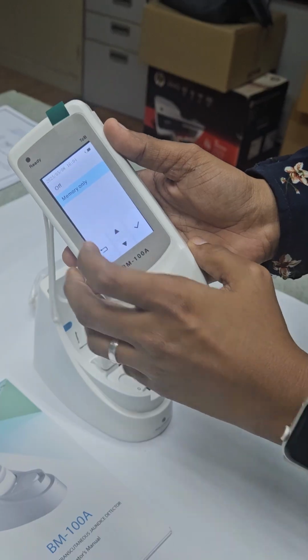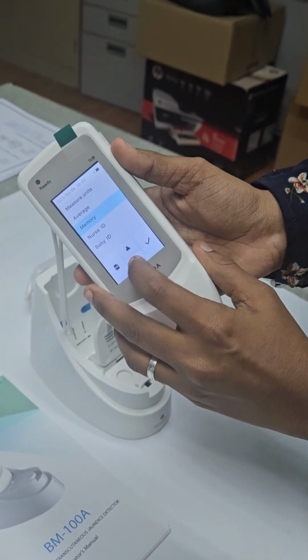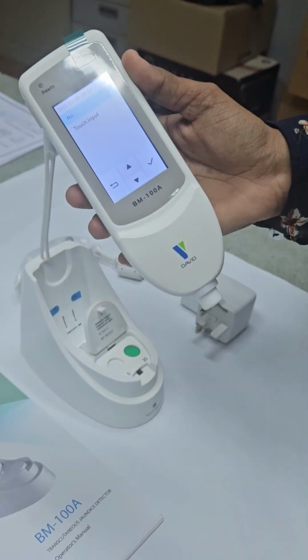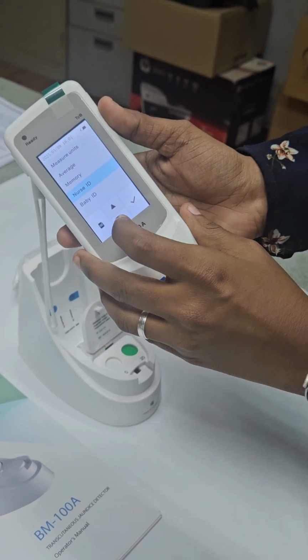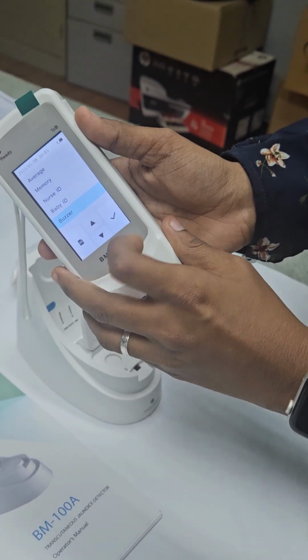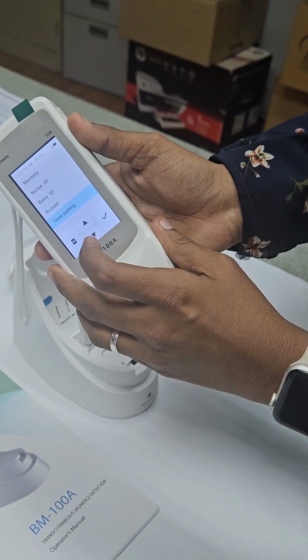Memory, currently it's off because it's a new unit, so we will turn it on. Nurse ID, there's an option to turn off the nurse ID. If not, we have to key in the nurse ID. Okay, baby ID is compulsory. Buzzer is the key sound. Time setting, I already set the timing.